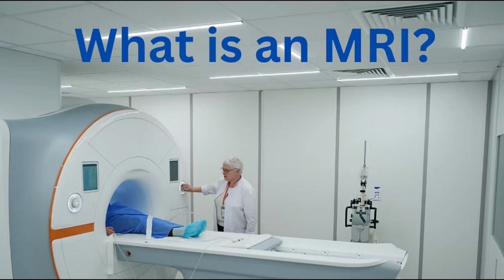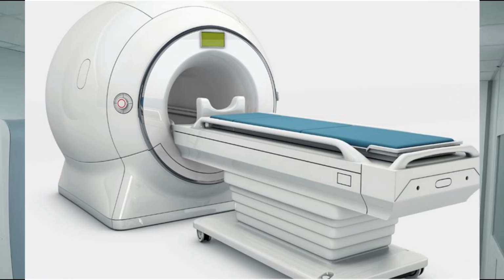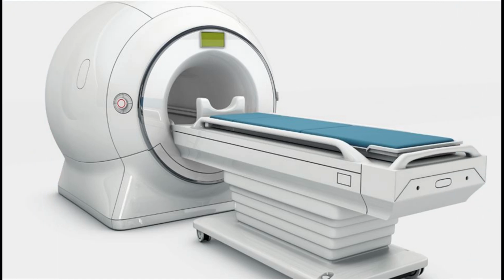Since its development in the 1970s and 1980s, MRI has proven to be a versatile imaging technique. While MRI is most prominently used in diagnostic medicine and biomedical research, it also may be used to form images of non-living objects, such as mummies. Diffusion MRI and functional MRI extend the utility of MRI to capture neuronal tracts and blood flow respectively in the nervous system, in addition to detailed spatial images. The sustained increase in demand for MRI within health systems has led to concerns about cost-effectiveness and overdiagnosis.